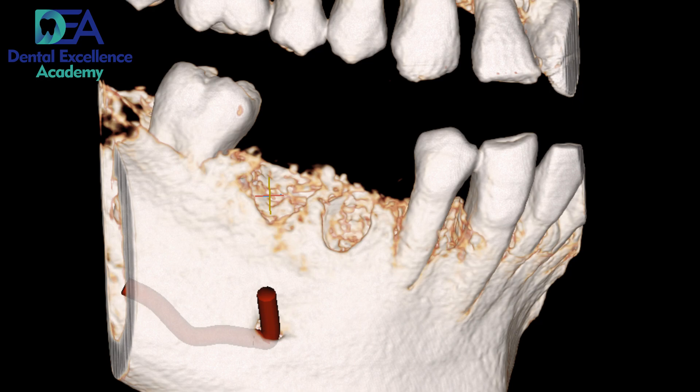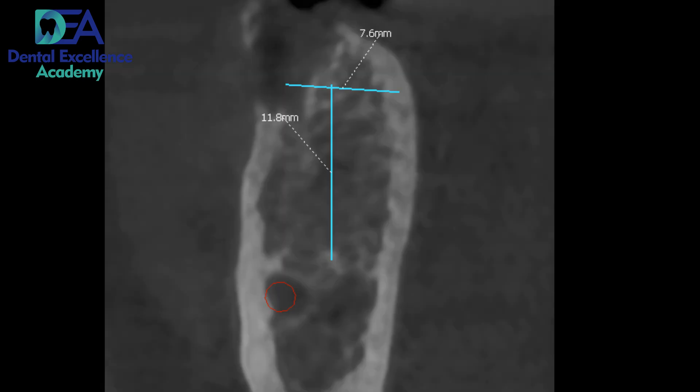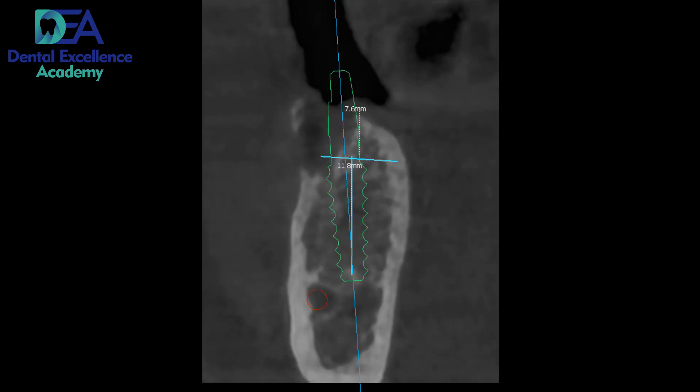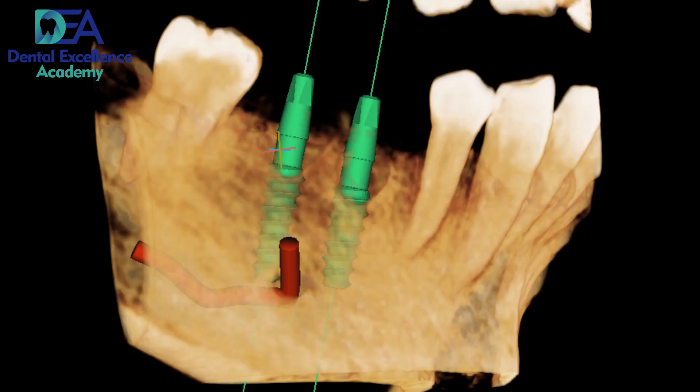We are placing implants in the region of 45 and 46, that is the lower right region. We have taken a CBCT and planned the case accordingly. We have calculated the width and height. These are the digital implants we have placed — you can see we have placed two implants.